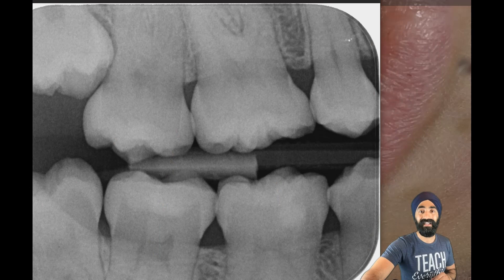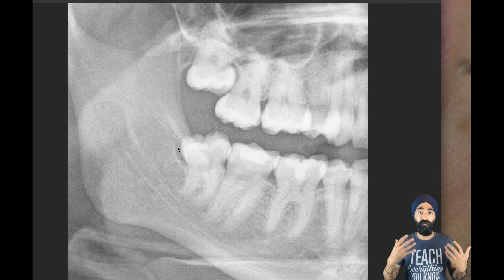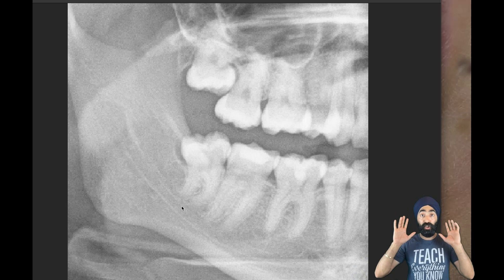Looking at the OPG, we see this radiolucent band distally, which is a sign of chronic infection. This patient has been suffering with pericoronitis multiple episodes, which is why we're removing it. I'm not worried about any nerve risk because you can see the tram lines and there are no high-risk sign features.